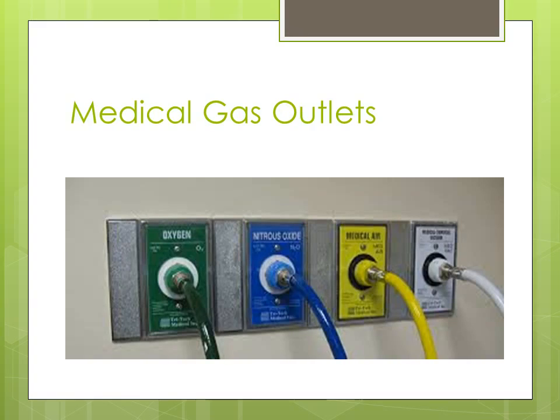new personnel, or maybe somebody didn't put the adapter back, and so they get to a code and they need to connect something, and guess what? They can't connect. So they scramble to find an adapter or a connector, and that delay obviously could create an issue for patients. And we had a situation like that when we ended up going through and standardizing our outlets, and it took quite a while.